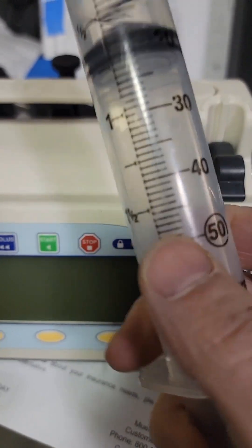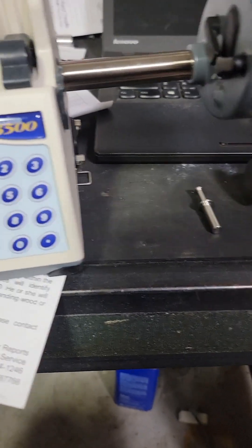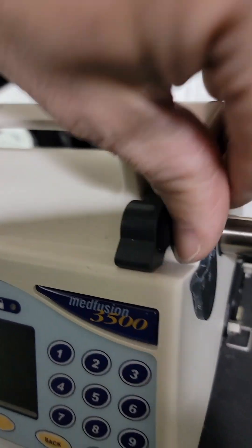That's your plunger, this is your barrel. And this guy over here is your syringe barrel flange clip — that's where this guy goes.